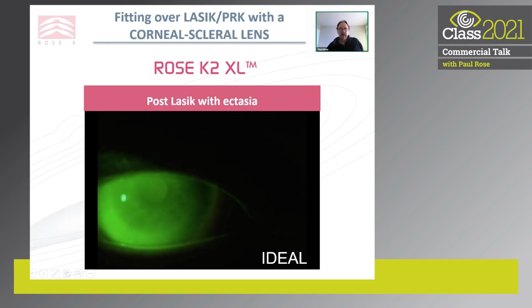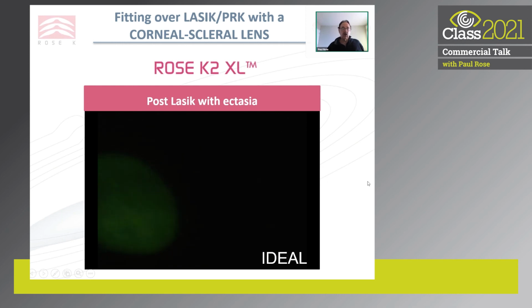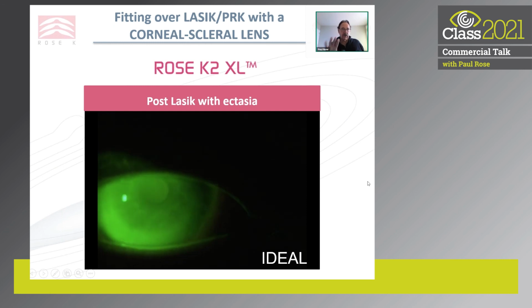So here's a post-LASIK case with ectasia, and you can see as the patient's blinking, we're getting light touch. I'm very happy with that fit. As long as I see that the touch is not there all the time, I'm very happy. I'm very happy with that fit.